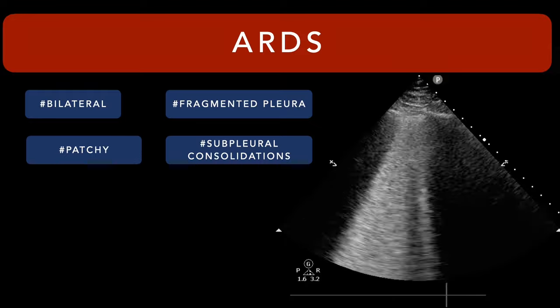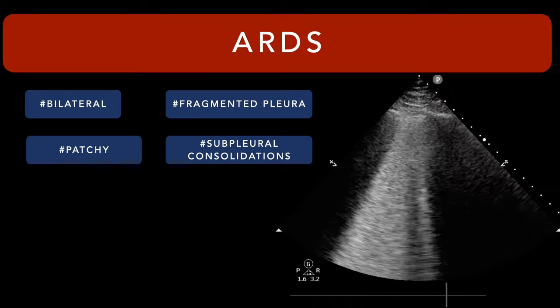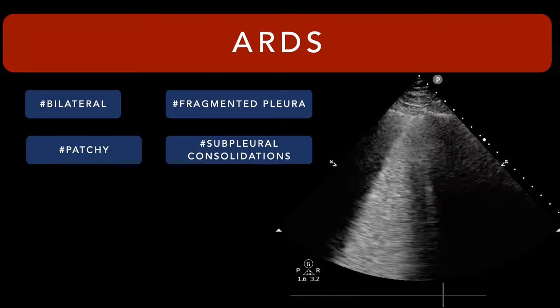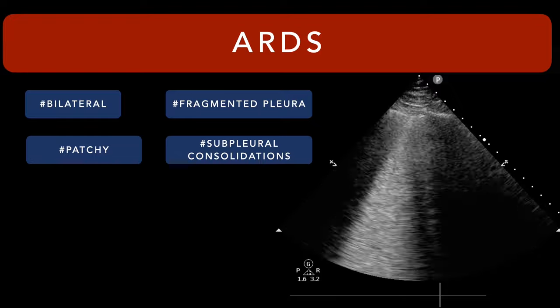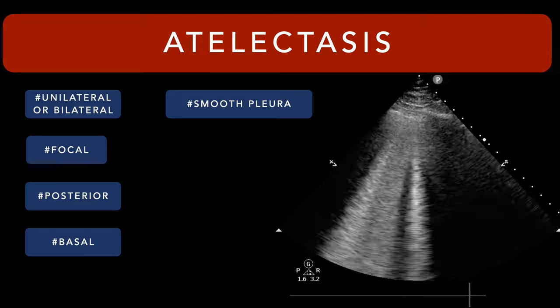So has the patient then clinically been in the ICU for a little while, been on the ventilator for a while? Do they have a story that's consistent with their ARDS? And if so, you can use this to help monitor their progress as you're ventilating the patient and trying to get those lungs to heal, right? And finally, well, we got a couple others.